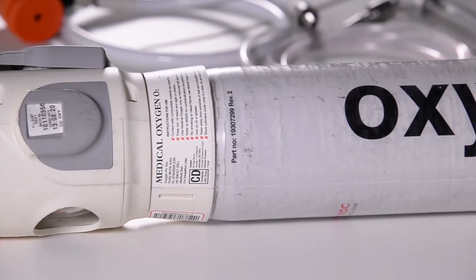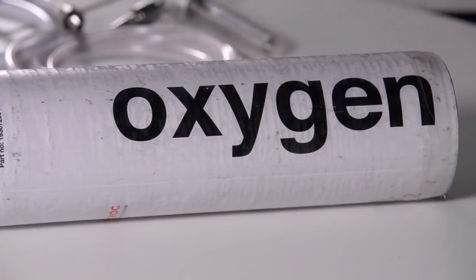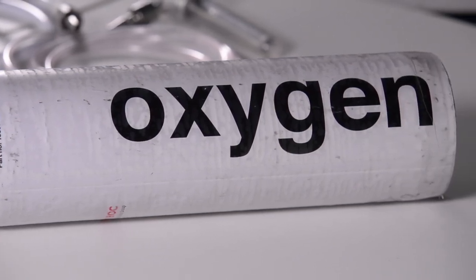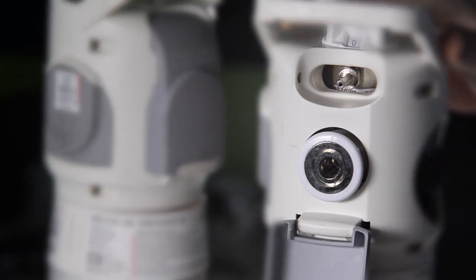When selecting the cylinder for use, check the cylinder is clean and free from any damage. Ensure the cylinder is free from oil and grease, particularly around the Schrader and fir tree outlets.